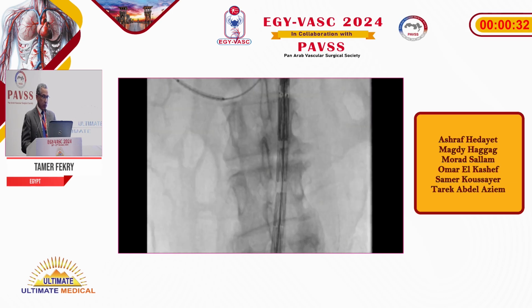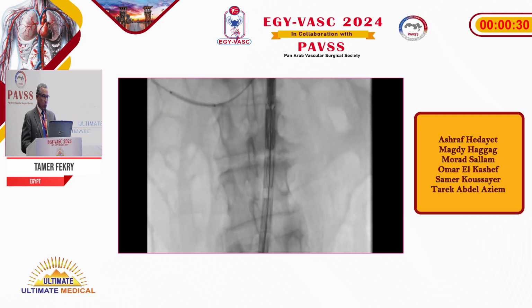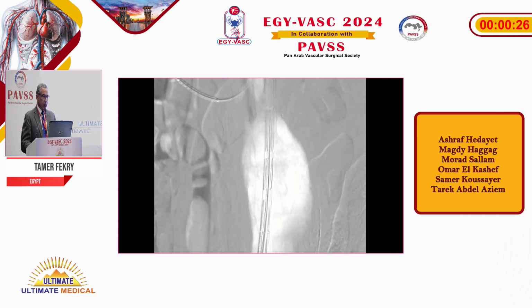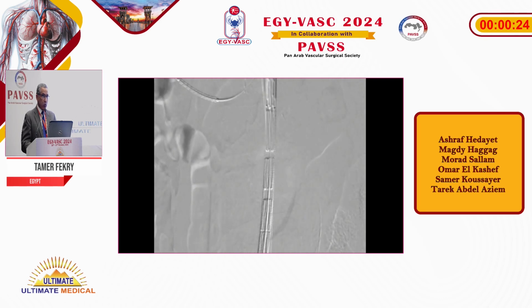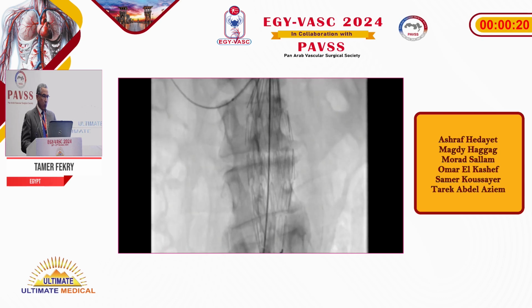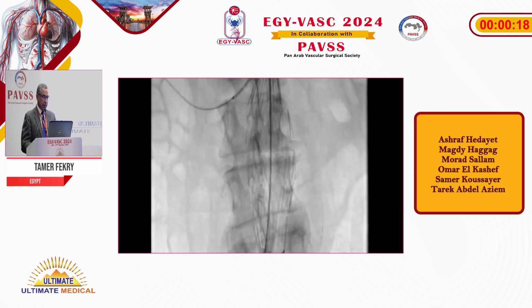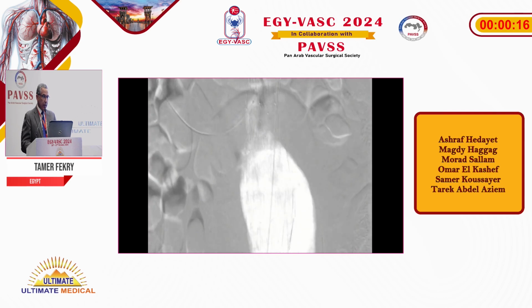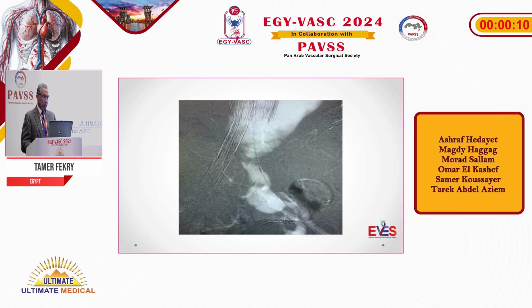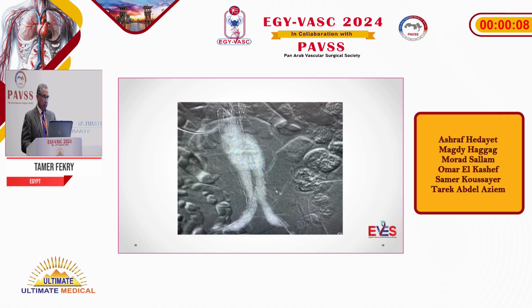We inserted the stent, and we started with the main body, and we are now taking another CO2 angiography. We placed the renal stents, and we started to open the body, and everything went okay, and we didn't need a single milliliter of contrast agent. And here is the post-completion CO2 angiography.